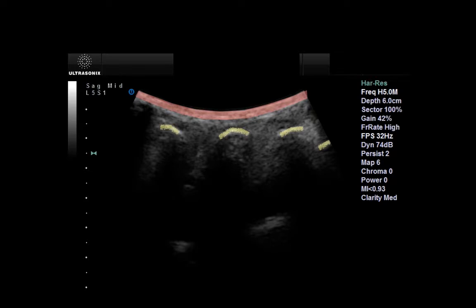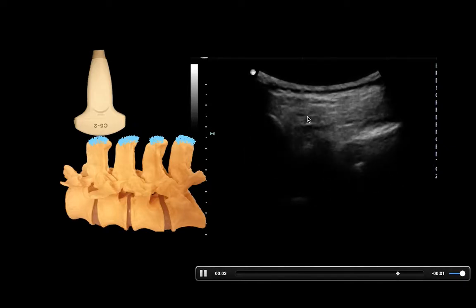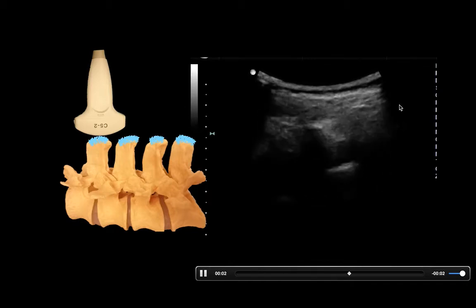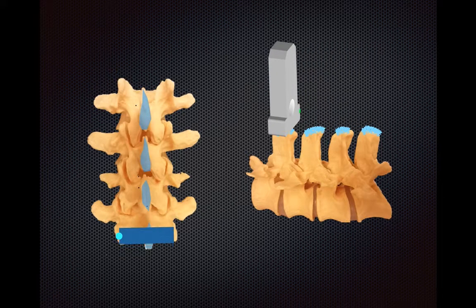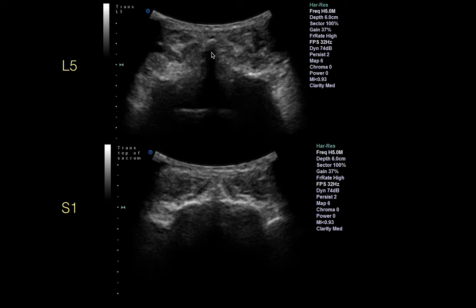You can kind of walk backwards and then figure out which interspace you want to target. If you do a linear scan down the midline, you can see the spinous process elements and then the sacrum more distally. In a transverse scan, what you're going to do is scan up and down the spine to look for and identify the midline. What you're going to look for are the spinous processes at the very top with the shadowing distally to that, and you want to line these up in the midline of your transducer.